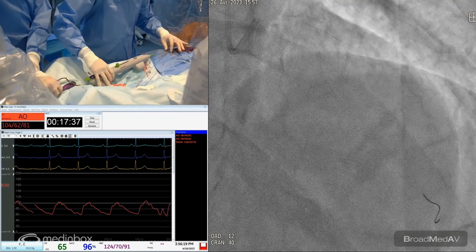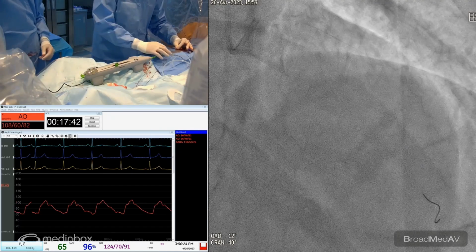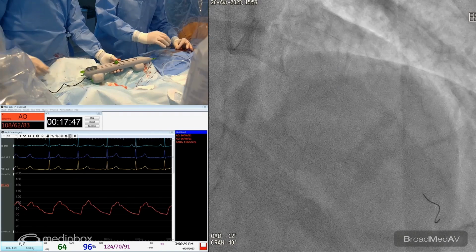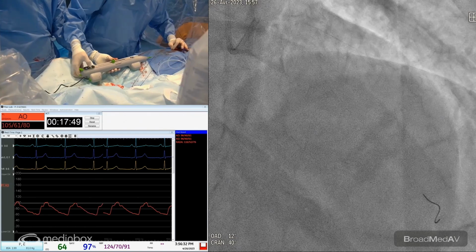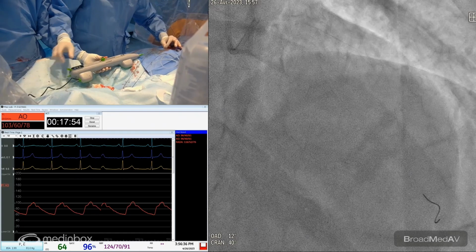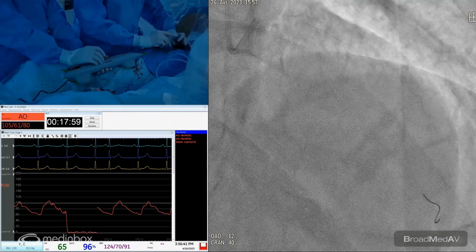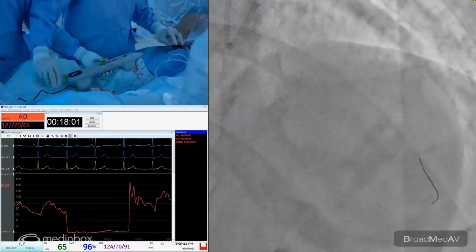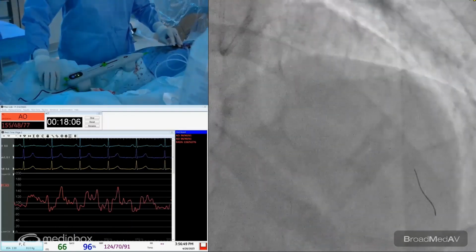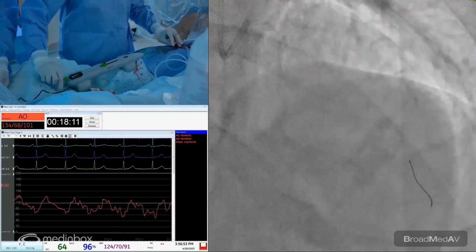So here's the device. To test it, you lock and then you test. Like button, this is how it works, off. So it's good to go. Then we'll get the flashing button on. We'll go on glide assist. And the one-man technique is like I show you. I pull with one hand and I advance with the other hand. Can you please take the wire? Be careful of the wire. Until you reach the tip of the guiding.